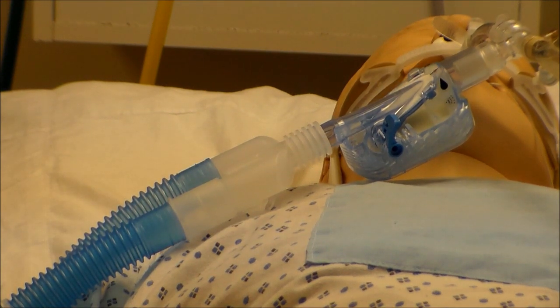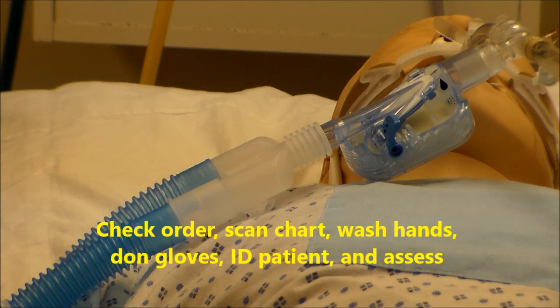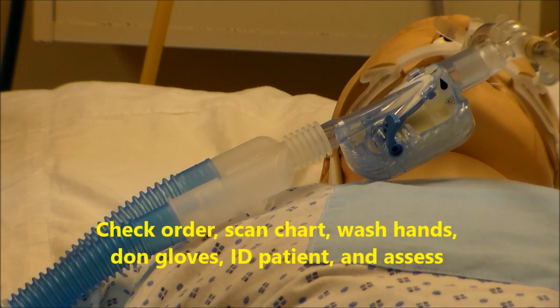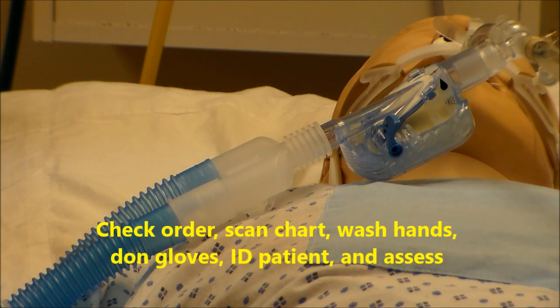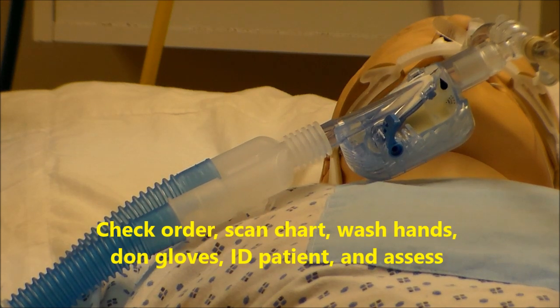Now we're going to be giving an MDI in line with a vent circuit. Make sure you check your order, come in, assess your patient, and listen to breath sounds.